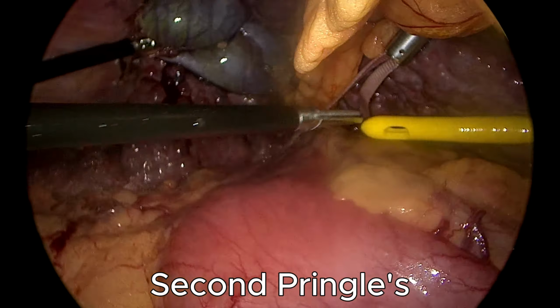With preoperative imaging guidance from CT and intraoperative ultrasound, we can now demarcate the resection line on the liver surface using electrocautery, shown by the arrow here. A margin of at least 1 centimeter around the tumor is ensured to achieve clear, tumor-free margins. We took more margin than recommended.